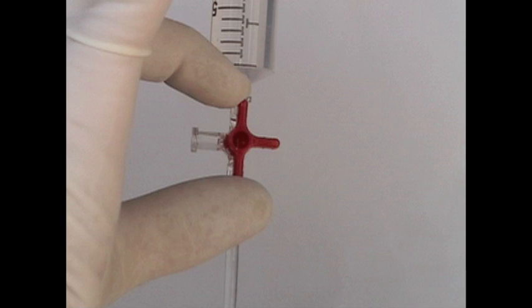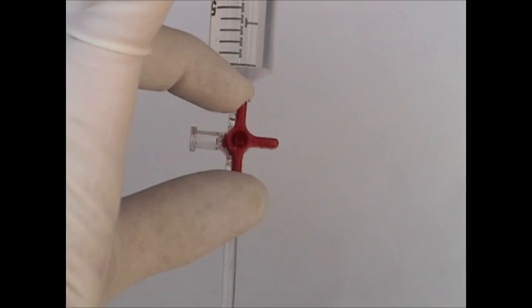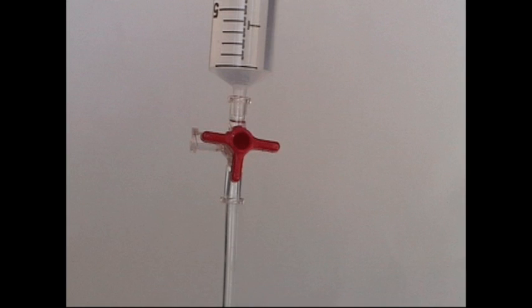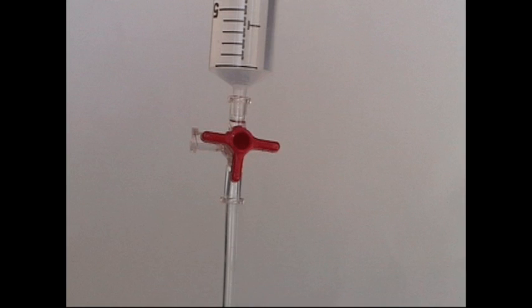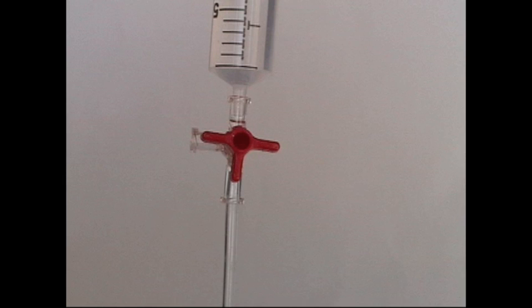If the tip of the epidural needle is indeed located in the epidural space, the fluid will passively flow through the epidural needle and air will be entrained into the extension tubing. We only allow a small amount of air to enter the tubing, approximately 1 mL. The crux of the Gravity Flow Technique is observation of fluctuation of the level of the fluid within the extension tubing in sync with the patient's heart rate. This fluctuation provides indirect visual confirmation that the tip of the epidural needle is indeed positioned in the epidural space.